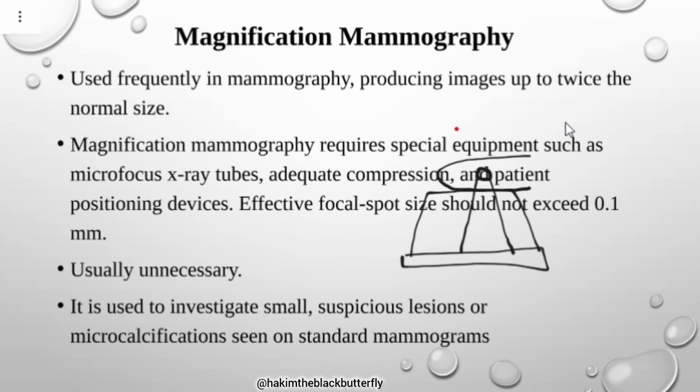That's why self-breast examination is not sufficient for you to know that you are okay or not okay. So in order for you to be at peace, you also need to do the screening to see whether there are microcalcifications that are growing without your knowledge. Breast screening can be performed in any facility that has a mammo machine. They can do both screening and diagnostic. Have I answered you? Yes, you've answered me.